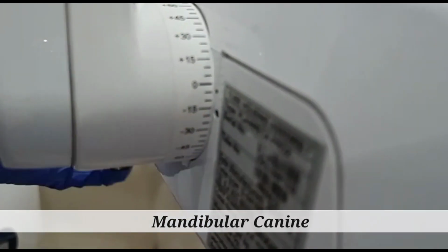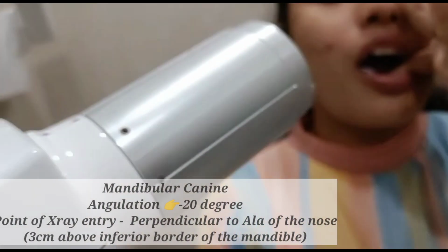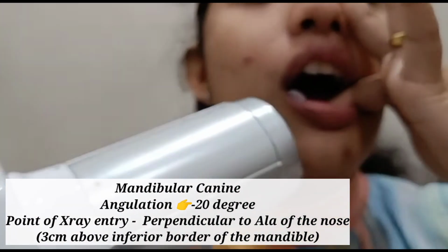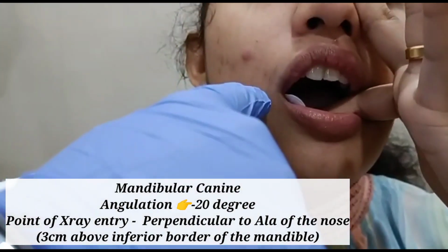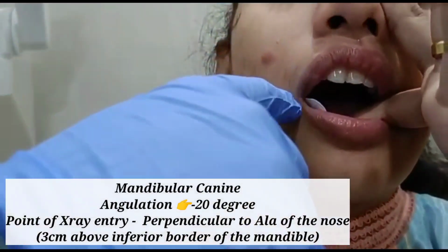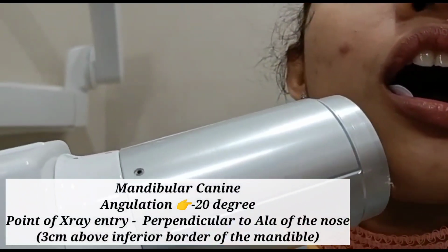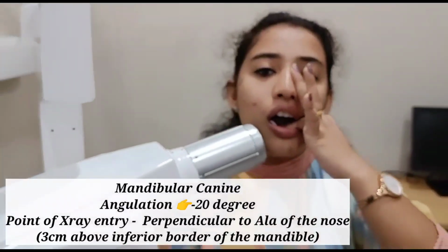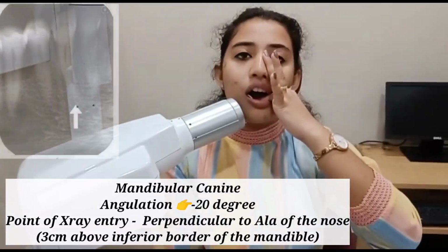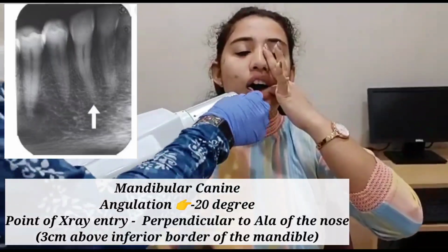And here we are positioning the vertical angulation, which is -20 degrees for the canine projection, and we direct the X-ray tube head in such a way that the central ray is directed through the mesial contact of the canine, and the point of entry is nearly perpendicular to the ala of the nose over the position of the canine, that is 3 centimeters above the inferior border of the mandible. So this is how we direct the central ray for the projection of the mandibular canine.